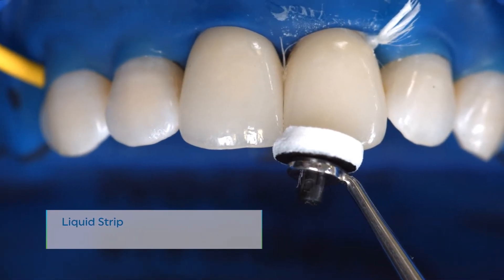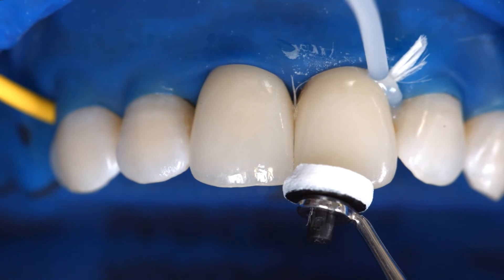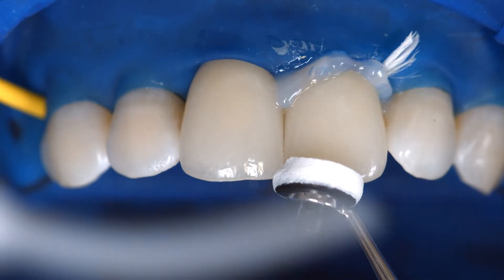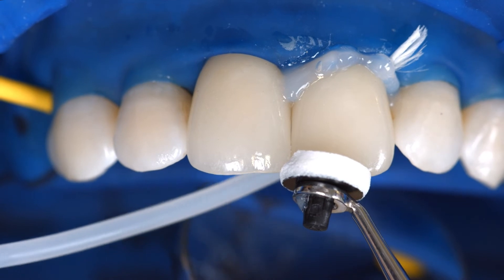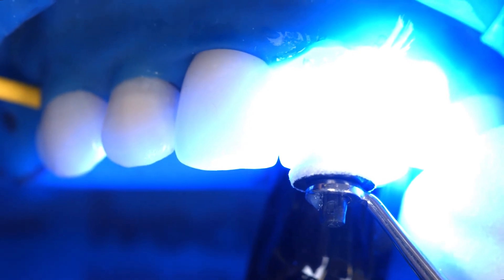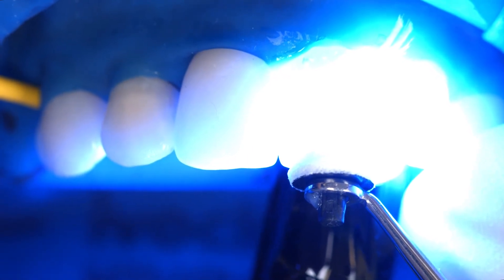Like all other composite resins, Variolink Aesthetic LC is subject to oxygen inhibition. To counteract this effect, cover the restoration margins with glycerin gel or air block immediately after having removed the excess cement. Liquid Strip is an ideal product for this purpose. Light cure all cement lines again for 10 seconds per segment and per mm ceramic using, for example, blue phase style at a light intensity of 1100 mW per square centimeter.